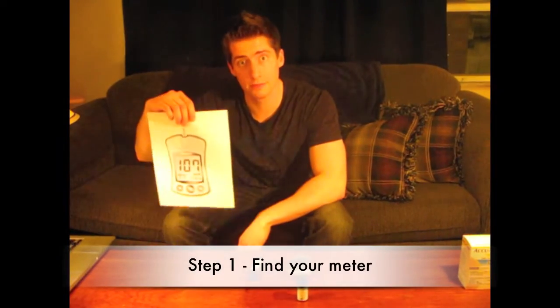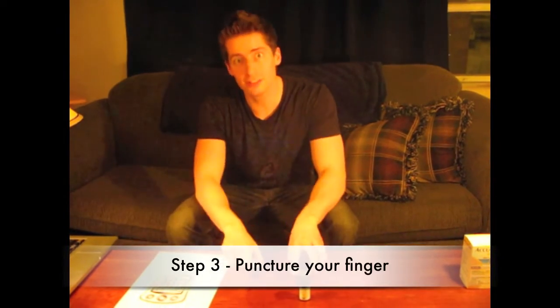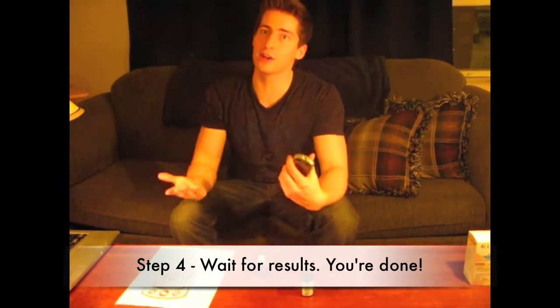Step one: find your meter — it's the glucose test. Step two: set up your meter — it's the glucose test. Step three: puncture your finger — it's the glucose test. Step four: wait for results. You're done.